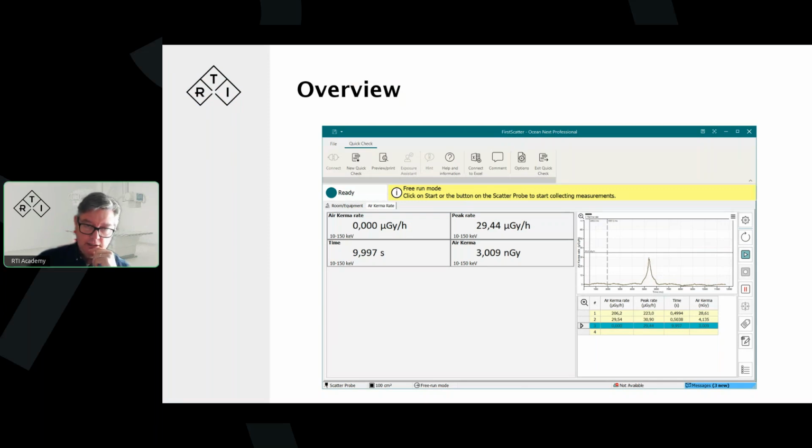We did have in the first versions of the software a bit of a glitch. The filter we had in there allowed negative dose values to be shown. And of course, that is not very intuitive. So we modified that a little bit. Now we have a better filtering effect with the more recent software versions. There we go.